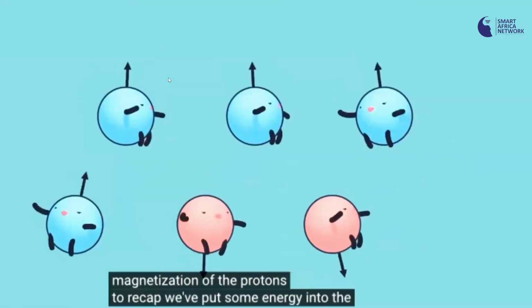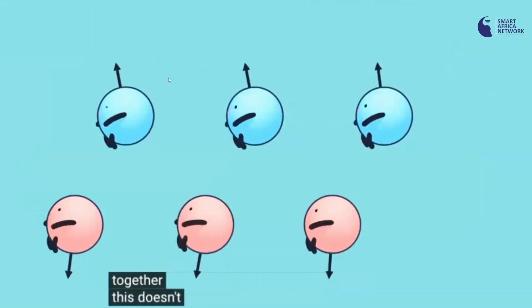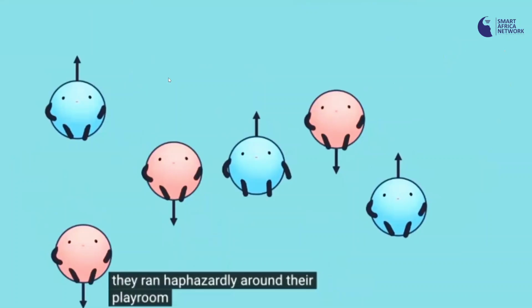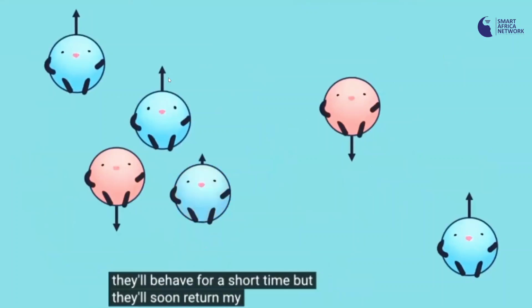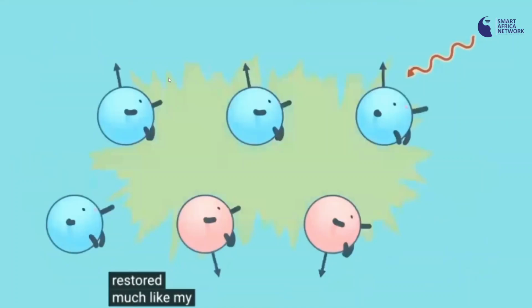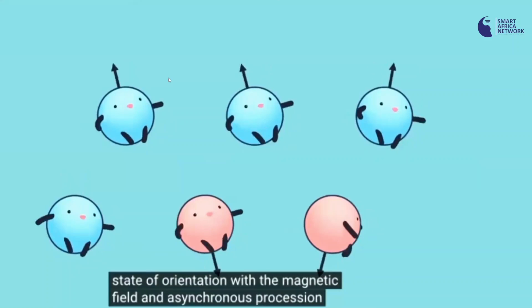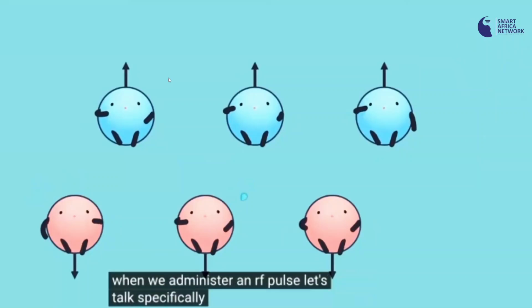To recap, we've put some energy into the system and temporarily convinced each of these protons to sit down and get it together. This doesn't last long, much as if you were knocked off of your feet or if I yelled at my wild little children as they ran haphazardly around their playroom. Recovery is imminent. They'll behave for a short time, but they'll soon return my energy back to me as the baseline state of disorder is restored. Much like my children, the protons will recover or return to their original state of orientation with the magnetic field and asynchronous precession.